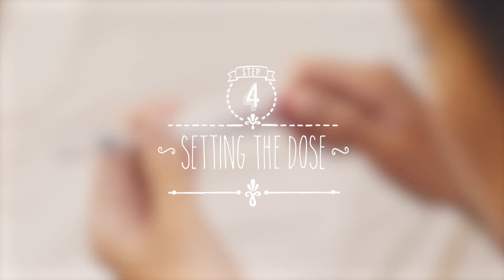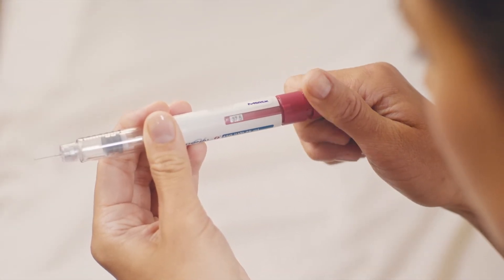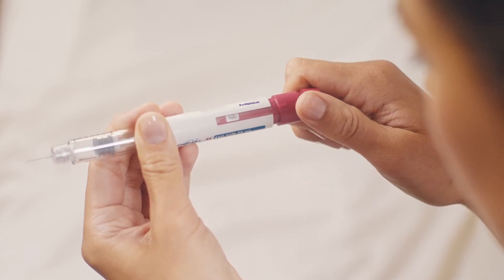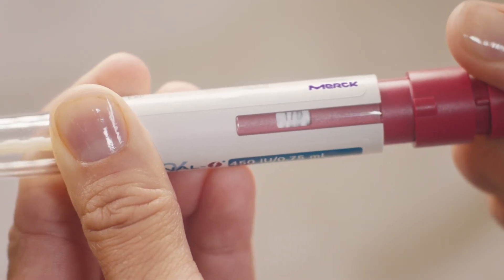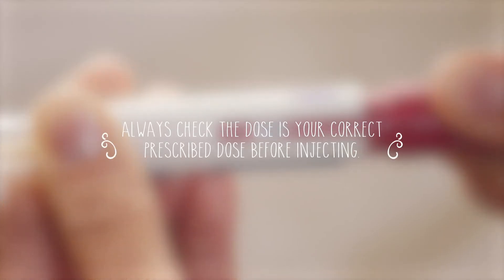Now we're ready to set the dose. All you need to do is turn the red dose setting knob until your prescribed dose appears in this window here, on the side of the pen. Don't worry if you go past it — you can turn it back the other way until you get the right dose. Make sure you double check that the dose you've set is the one prescribed by your doctor before you inject yourself.